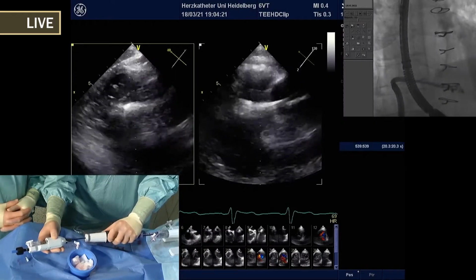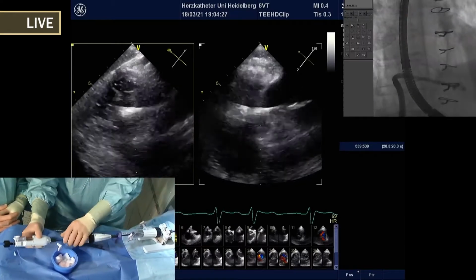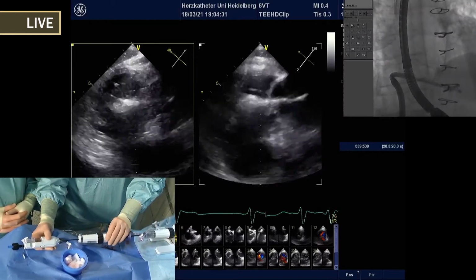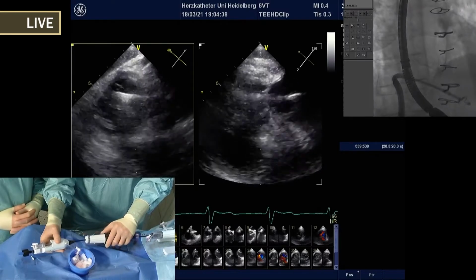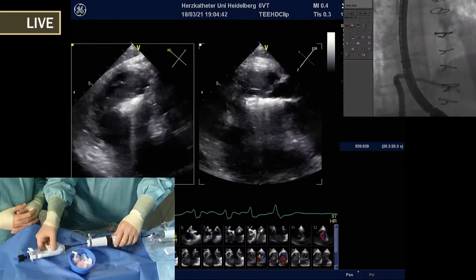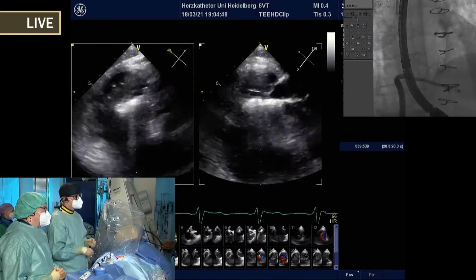The second point that may point to ICE in the next 6 months is that you can do tricuspid valve implantations or tricuspid repairs without any intubation or sedation, like TAVR. So I think tricuspid will become, over the next 2 years, a non-sedation procedure, perhaps. Interesting. Okay, let's go back to Heidelberg.